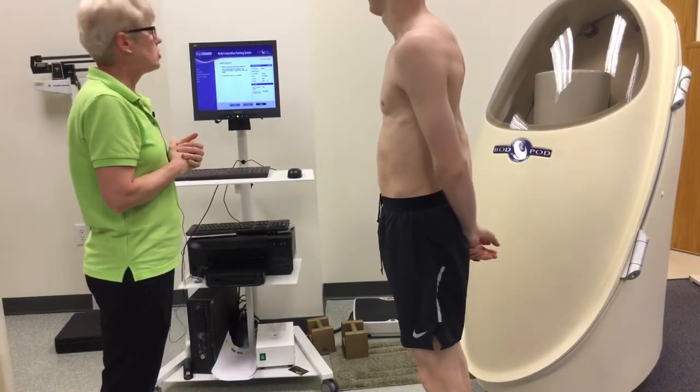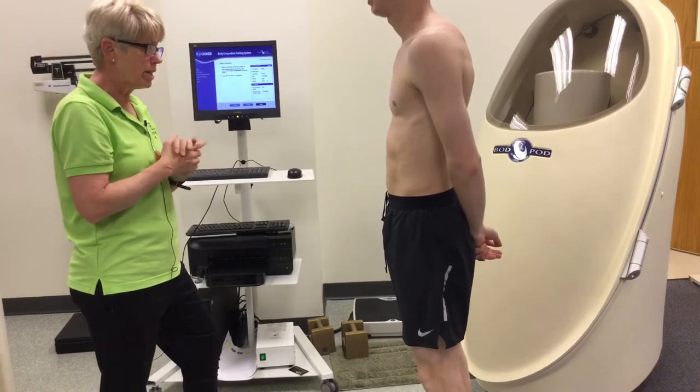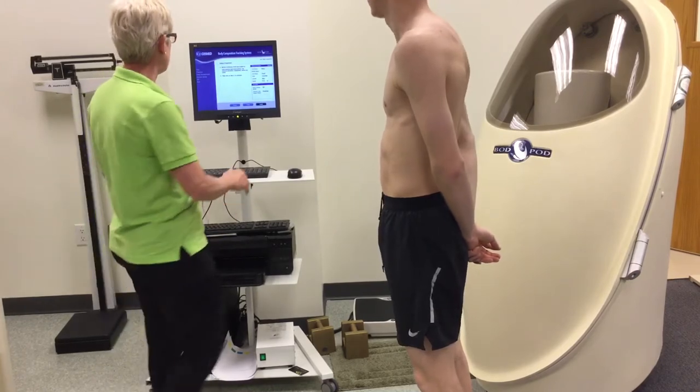Now we're ready for our subject. You need to make sure that your subject has the hat on, no jewelry, no piercings, no socks. They should be in spandex shorts — his running shorts have the sliders built in.